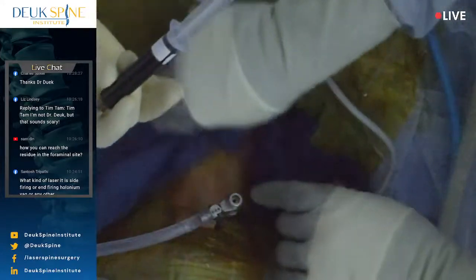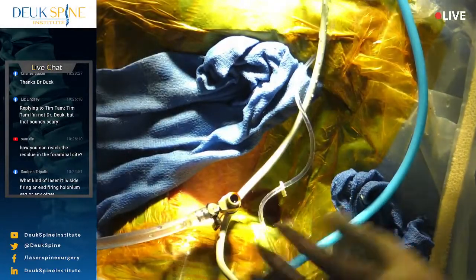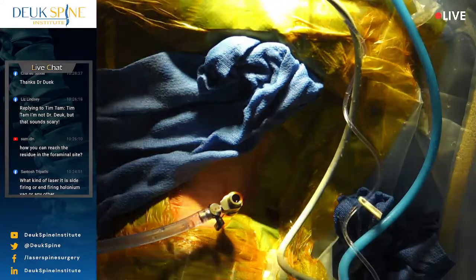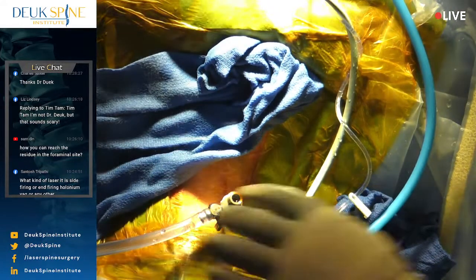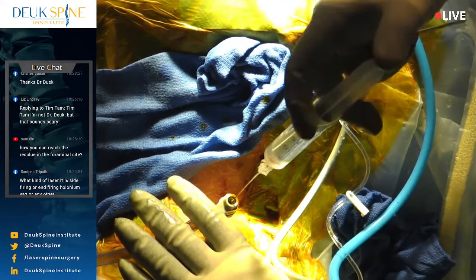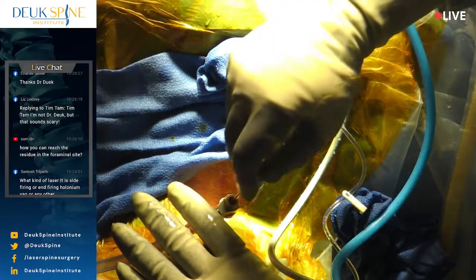All right, so we're going to put the light on. We're going to put a little betadine. We used to use bacitracin, but that's fallen out of favor. My entire surgery career was bacitracin. I need to suck this out, so you need to give this to me in the right sequence. Okay. It looks good. Take it. So we're going to just suck the irrigation out.